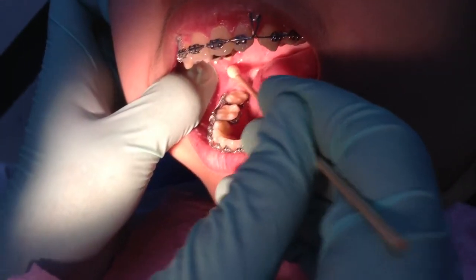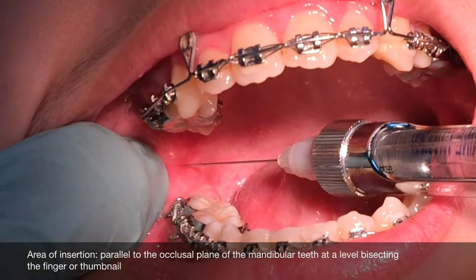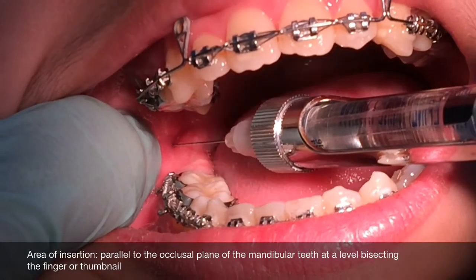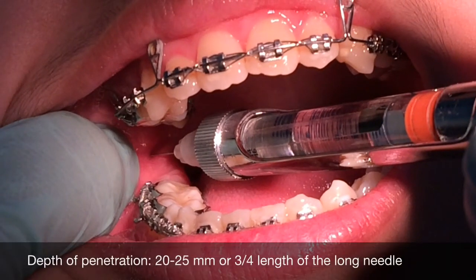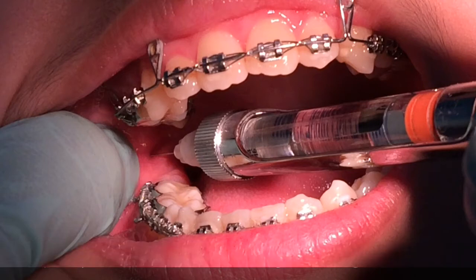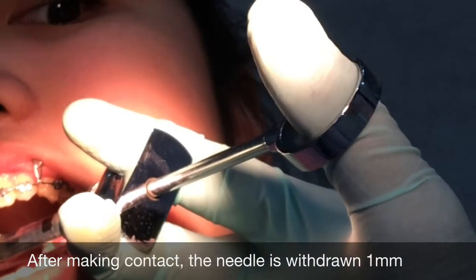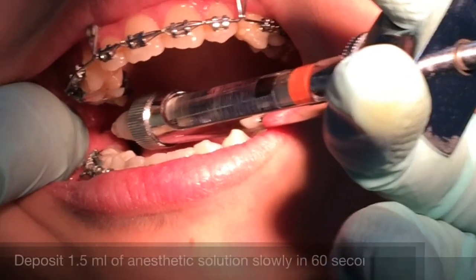This is the depression where the needle is inserted. A 25-gauge long needle is inserted parallel to the occlusal plane of the mandibular teeth from the opposite side of the mouth, about an inch away at the level of bisecting the finger or thumbnail until bone is contacted. Depth of penetration to bony contact is 20 to 25 millimeters, or two-thirds to three-fourths the length of the long needle. After making contact, the needle is withdrawn one millimeter, then aspirate, then deposit 1.5 ml of anesthetic solution slowly over 60 seconds.